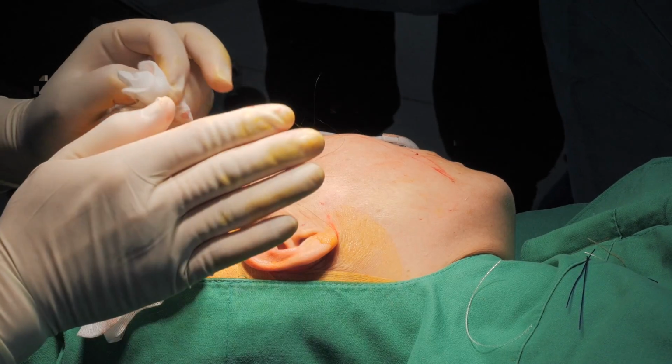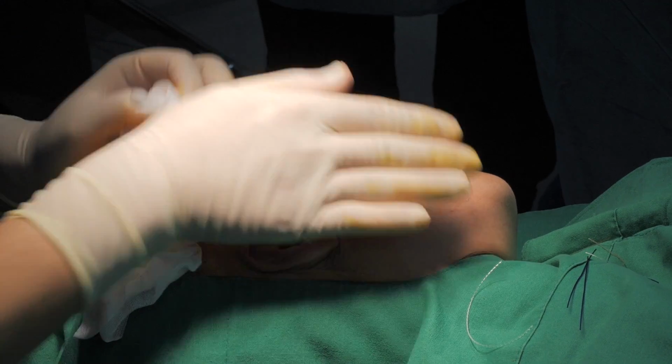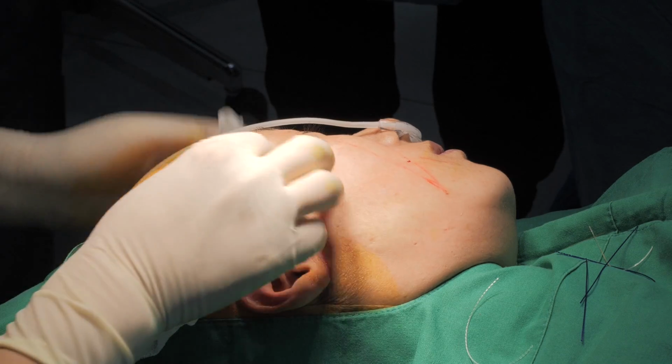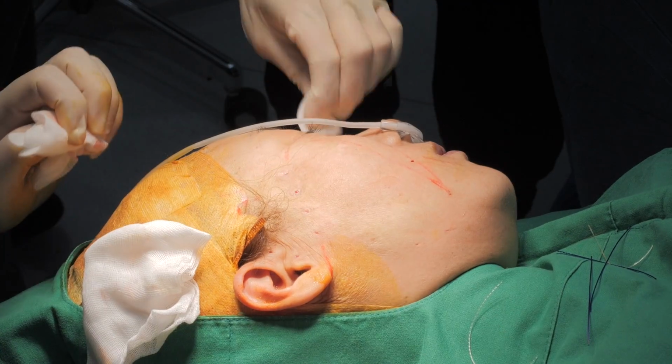I've completed the thread lifting on the lateral face. I will insert the thread from the jaw to the medial canthus and lateral canthus to correct the medial face.